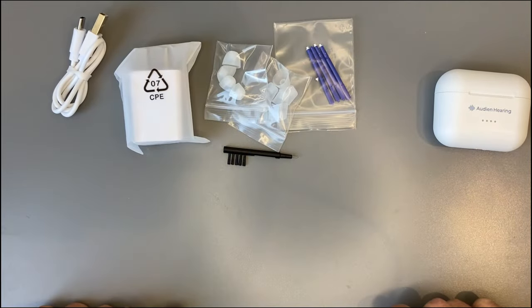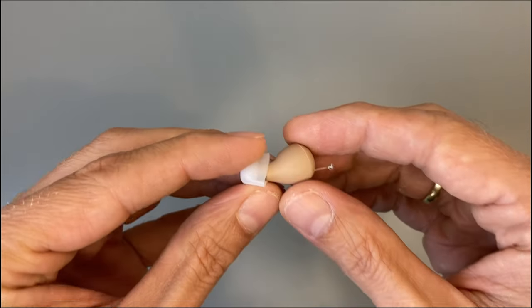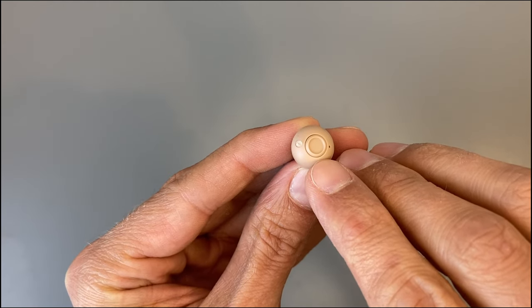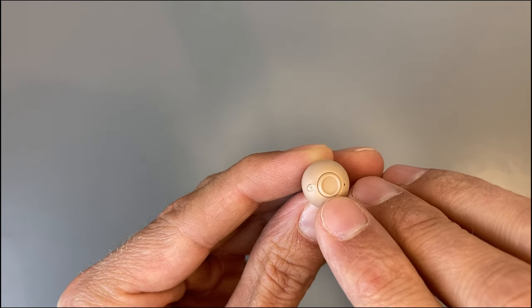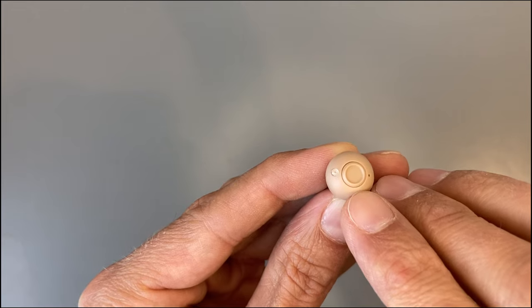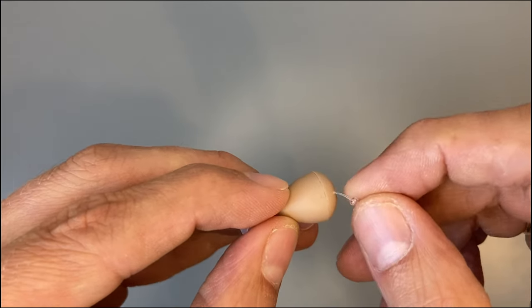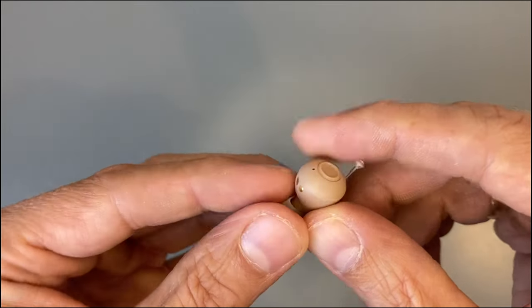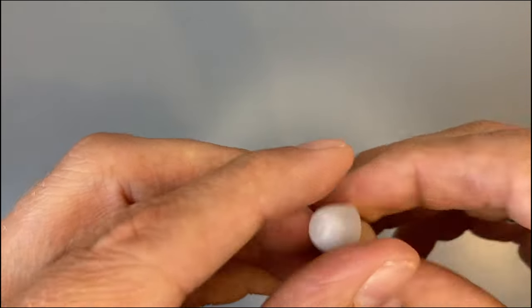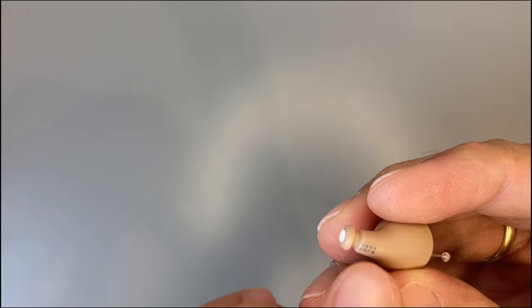Looking at the hearing aids themselves: it's a small device with a nice design. There's a big button to adjust volume and hearing programs — a short press of about one second adjusts volume, and pressing for three to four seconds switches through the hearing programs. There's also a microphone opening and a pull cord to help you remove the hearing aid from your ear. If you cut it off, the hearing aid still works but it's harder to remove. There's also a silicon dome, an earwax filter, a serial number, and charging contacts.